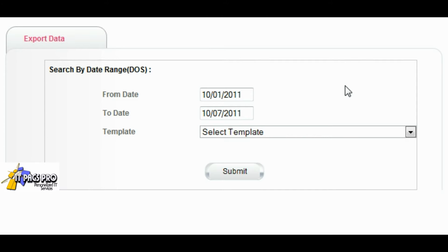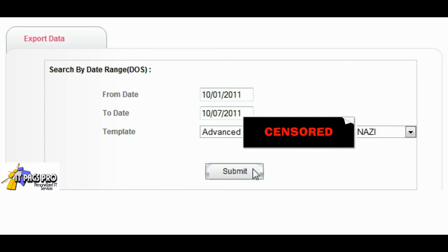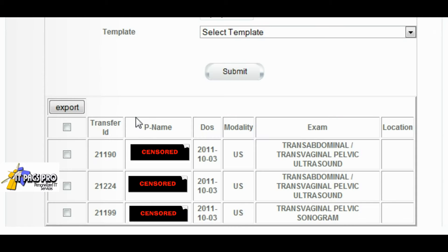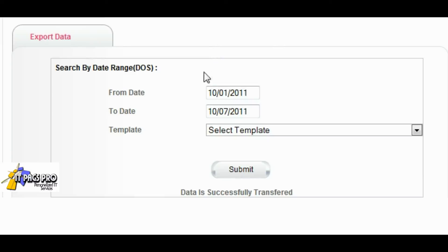Some imaging centers like to review the finalized reports prior to giving access to their referrers. We search and find our records, check off the records we wish to export, and click export. The data and PDFs have successfully been transferred.